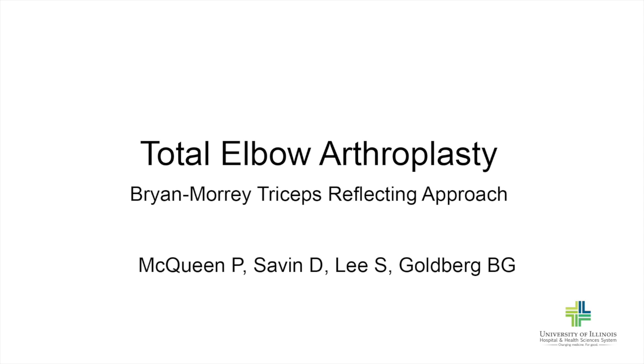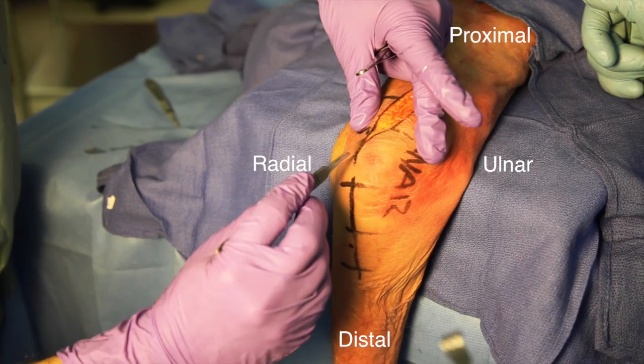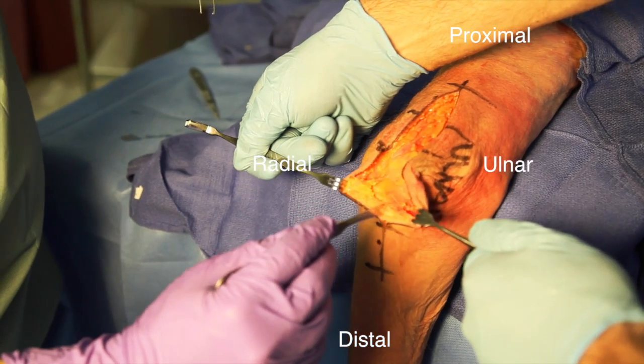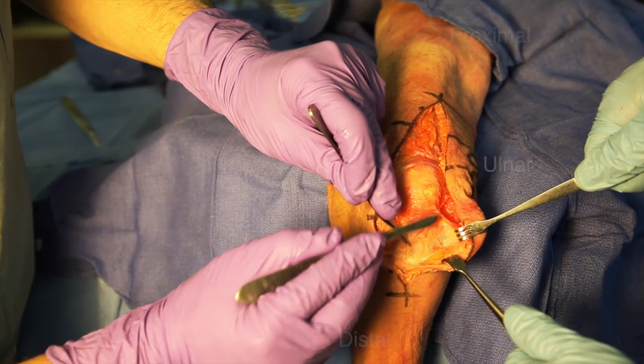This is a demonstration of total elbow arthroplasty using the Bryan Morrey triceps reflecting approach. A posterior incision is made approximately 15 centimeters in length, centered just lateral to the olecranon. The subcutaneous tissue is incised down to the level of the triceps fascia.